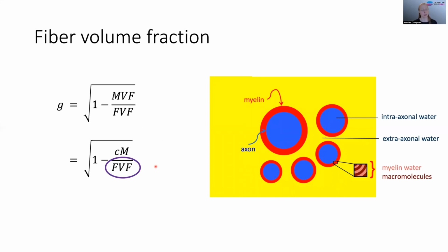So now we need to estimate the fiber volume fraction. There are a couple of possibilities. One is diffusion imaging, which would be sensitive to the fiber volume fraction because the diffusion displacement distributions in the different compartments are distinct. Another is the complex multi-echo GRE signal, where the phases of the different compartments would be distinct.